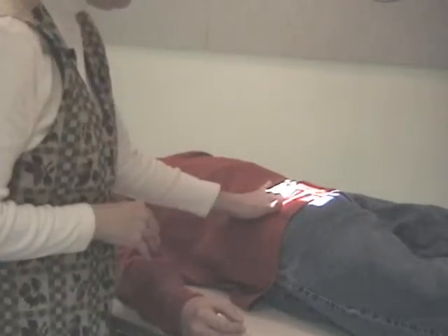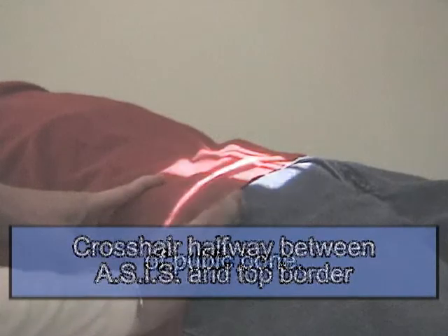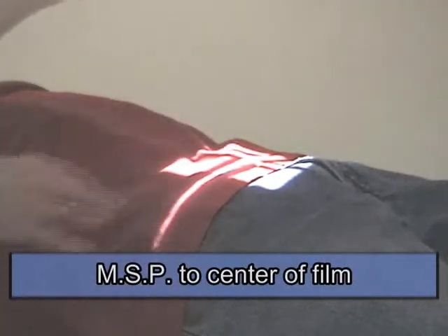Part film reference points. Come flat-handed onto your patient. Find the ASIS. Come in from the tummy side. Here's the ASIS. On a male patient, they will be in a gown. You won't have the underwear on, but Larry's pubic bone is approximately right here. The upper part is here. I'm not going to palpate. I can't see it on camera, but that's my estimate. And then the crosshair goes halfway between the ASIS and the upper border of the pubic bone. And the MSP is to the center of the film, and the patient is not rotated.